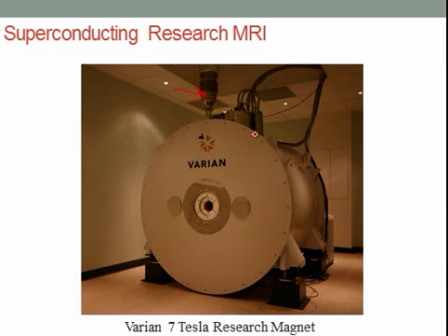It's kind of like a refrigeration cycle, where it gathers the tiny amount of liquid helium that boils off naturally, and recycles it through these tubes here. It goes back to what's called a heat exchanger in a different room, and then it returns the liquid helium to the tank. So theoretically, this system will never lose helium as long as the cold heads are operating.